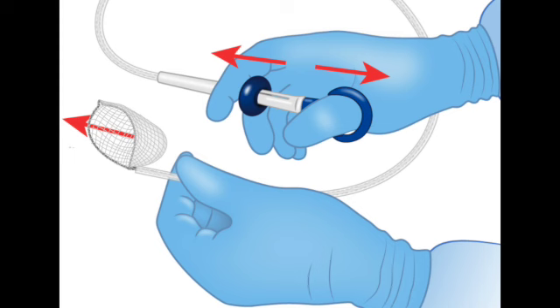All right, so the trap system works great for anything small enough to fit through the suction channel. But let's be real. Sometimes these polyps aren't pebbles. They're more like boulders, relatively speaking. Yeah. Too big for the scope's suction channel. What do you do then when suction just isn't an option?